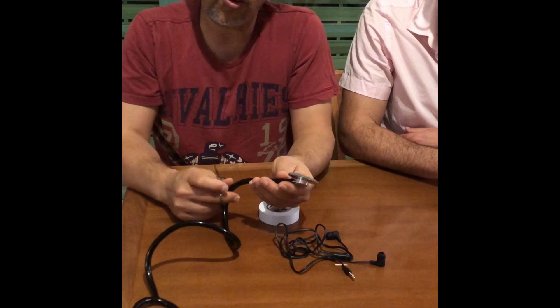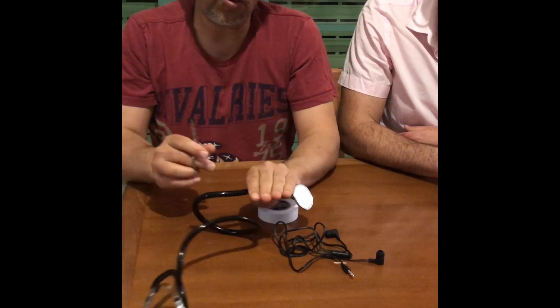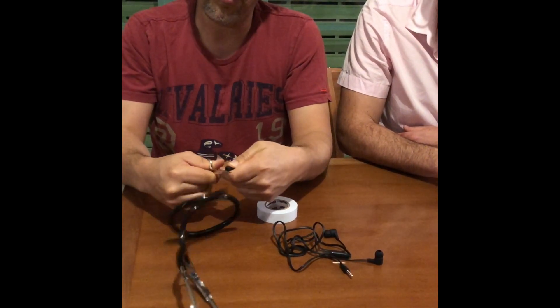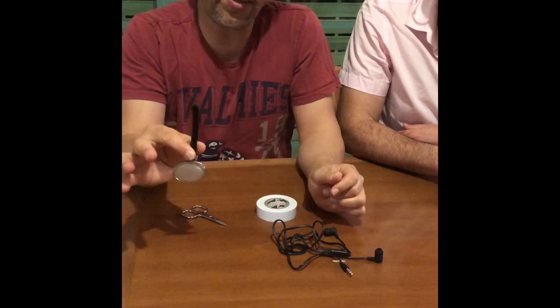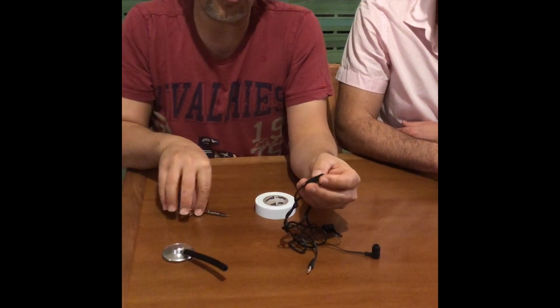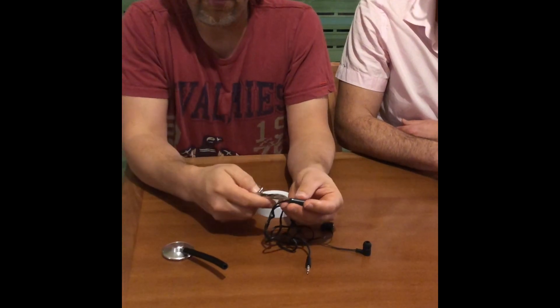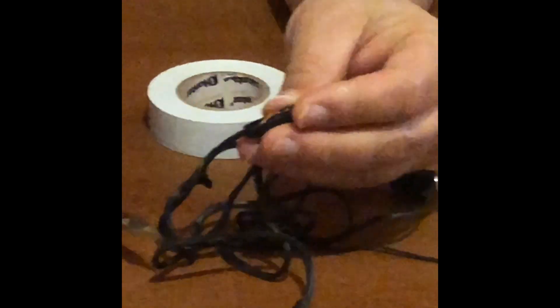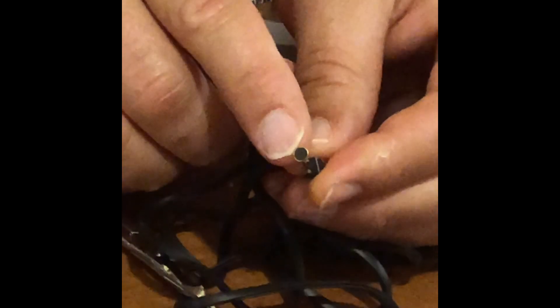We'll take the stethoscope and measure a distance of about four fingers, then cut the tube and be left with this part of the stethoscope. Then we'll look for the place where the microphone is located, open it delicately, and reach for the microphone. You can recognize the microphone by looking for a tube around this size with a bit of black material on top.